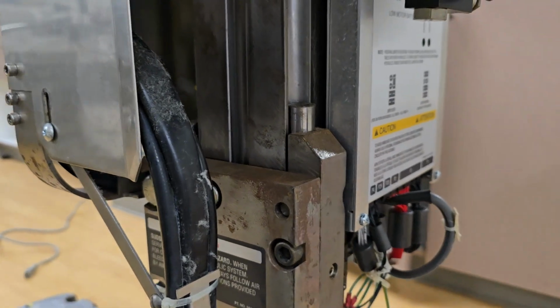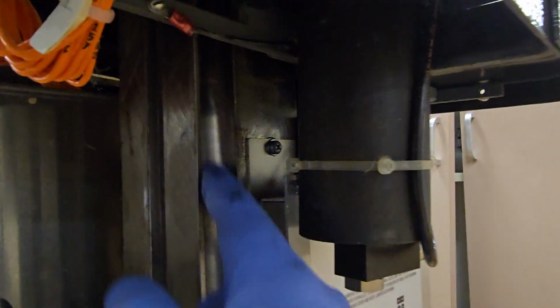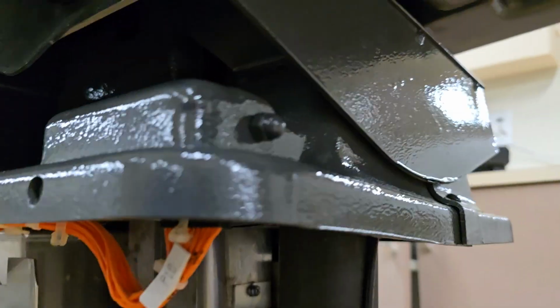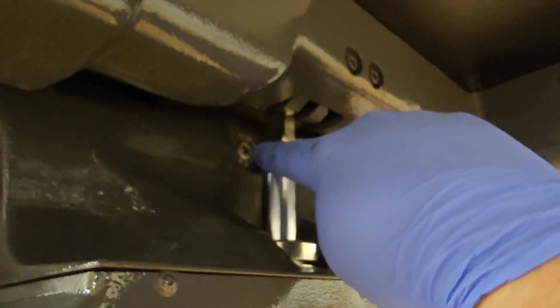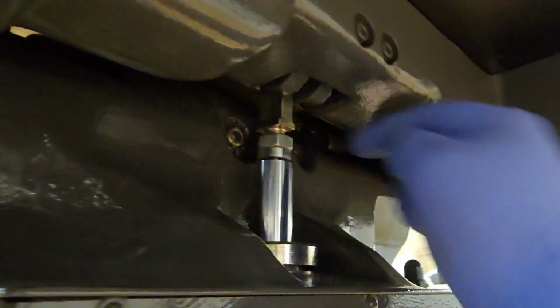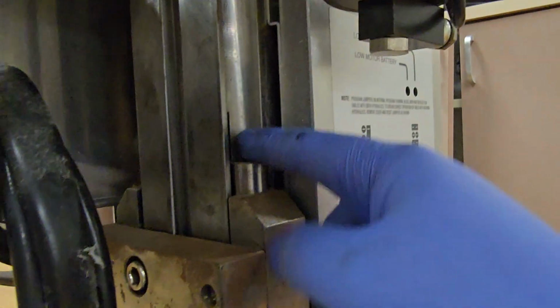Okay, right here you can see I have a linear rail. It's just a round rail. It's got a round groove cut in. Now there's a couple of areas where these tables are infamous for coming loose. One of them is up here at the gimbal. You can see that's one of the fasteners right there that needs to be tightened up. The other one is right here on this linear rail.